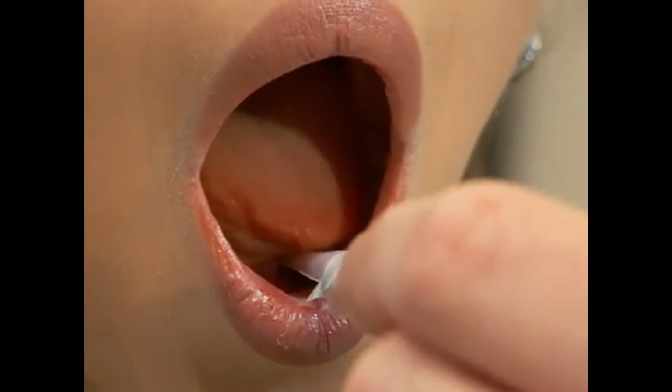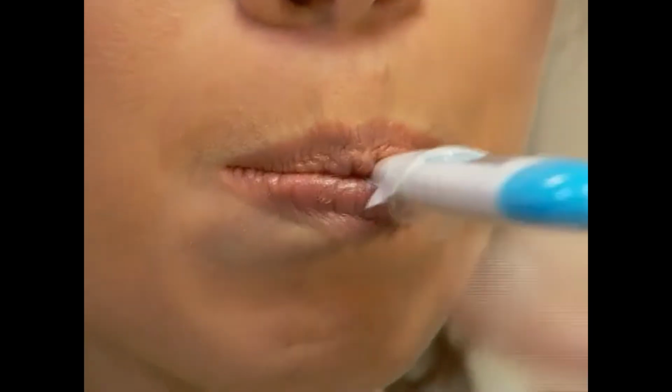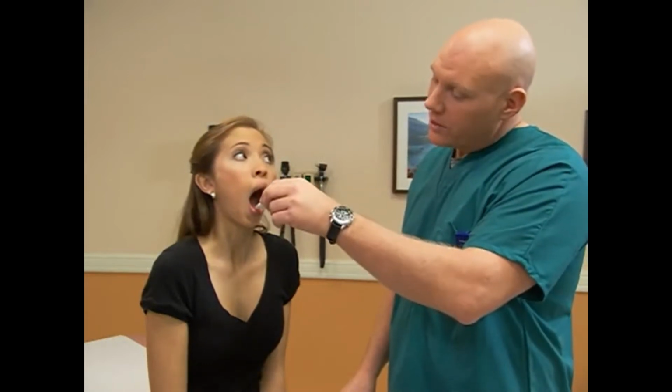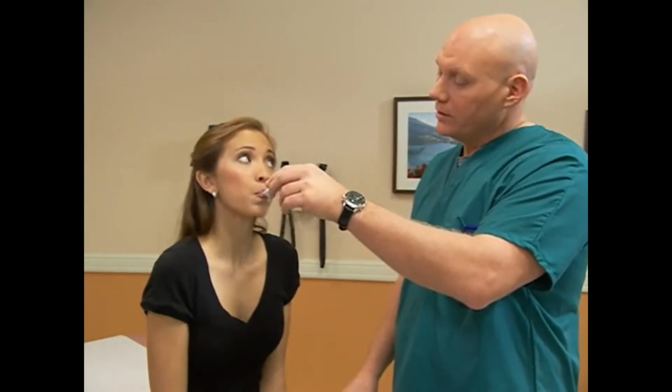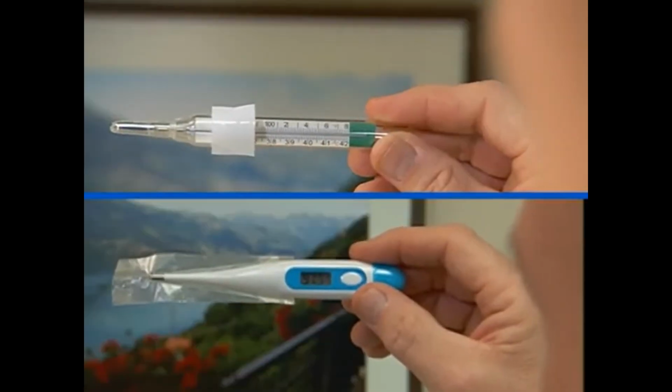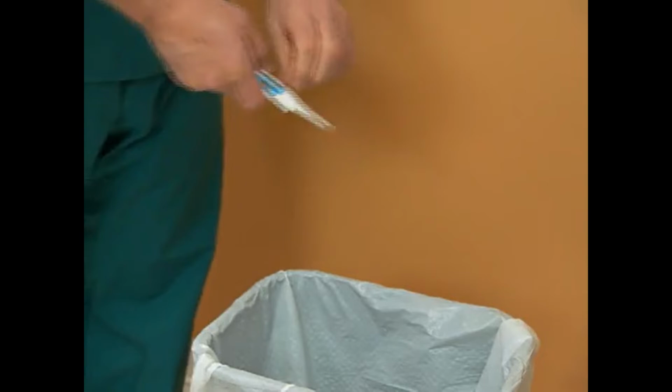Next, place the thermometer in the sublingual area of the base of the tongue, either to the right or the left of the frenulum. Keep your lips tightly closed and breathe through your nose, please. Carefully note the reading and record it immediately. Dispose of the used cover.